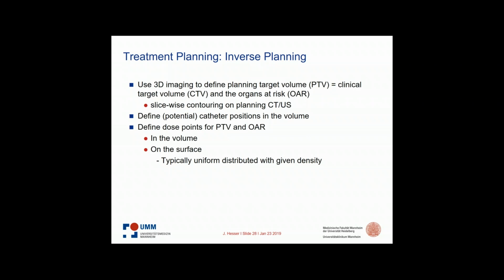Now comes the inverse planning. Many still do this planning by hand, but it is expected that in future this will be done more or less by software. What I'm going to do is describe one approach of how this inverse planning can be realized.